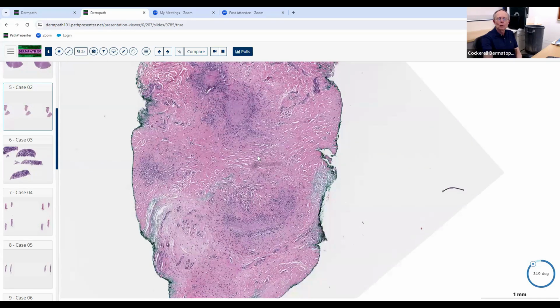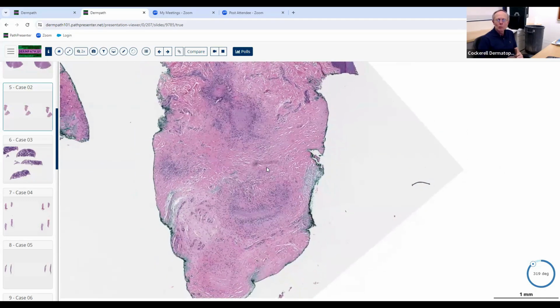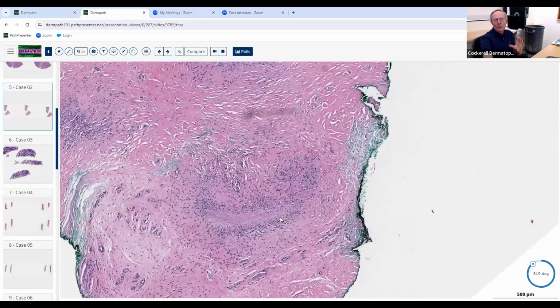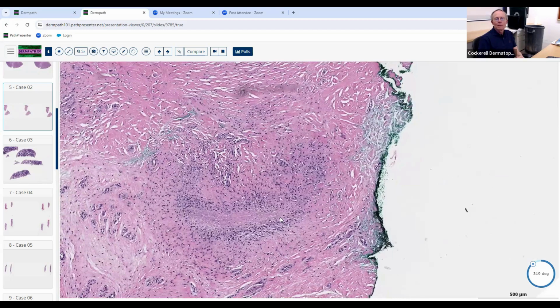And then rheumatoid nodule, usually when you biopsy those, it's a large nodular lesion. It's not usually something where you do a punch biopsy and you get two or three small annular-like rings with histiocytes in this palisaded pattern. It's usually a fairly large nodular aggregation with multiple large areas of palisaded granulomas with the pink fibrin. So basically, the overall pattern of the inflammation looks different also, in addition to what's in the center of the palisade.